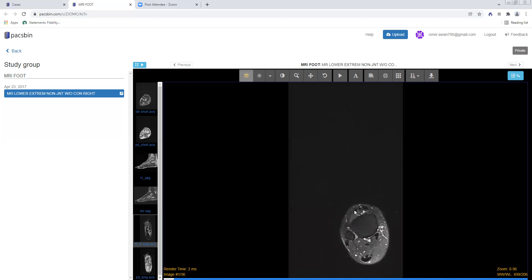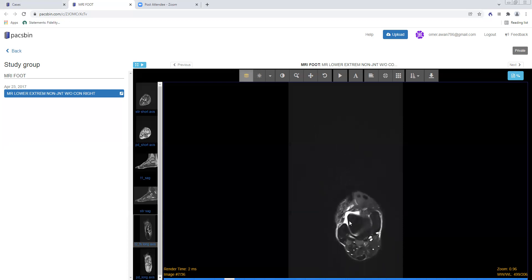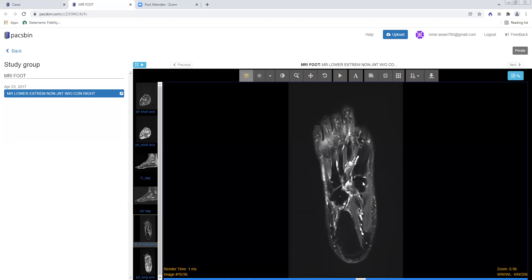Of course, we covered the ankle already, but we can see the three anterior extensor tendons — tibialis anterior, extensor hallucis longus, and extensor digitorum longus — and the three posterior flexor tendons: tibialis posterior, flexor digitorum longus, and flexor hallucis longus. Note that the tibialis posterior is twice the size of the flexor digitorum longus as it should be. You have the peroneus longus laterally and peroneus brevis more medially, and the Achilles tendon. We can also see the syndesmotic ligaments, the ATFL, the posterior talofibular ligament, and note that the calcaneofibular ligament runs deep to the peroneal tendons and is better seen on the coronal plane.